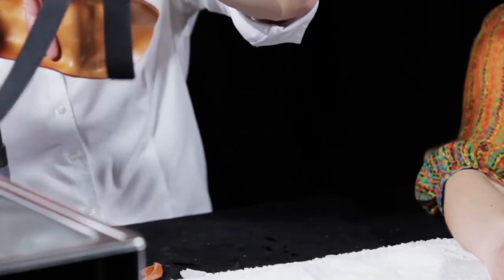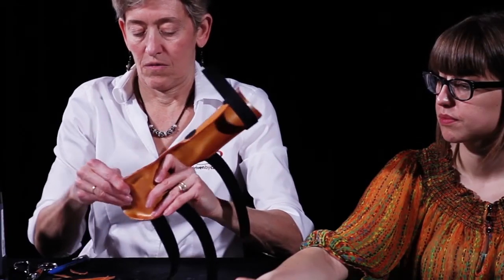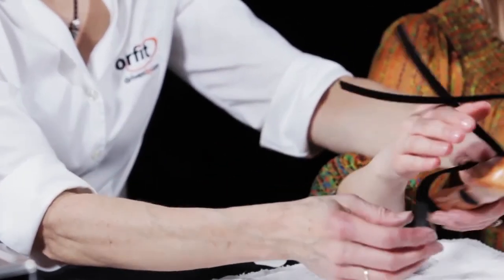Apply adhesive-backed Velcro hook on the opposite side of the orthosis. Make sure this hook stays in place by dry heating this adhesive and also by dry heating the thermoplastic material.